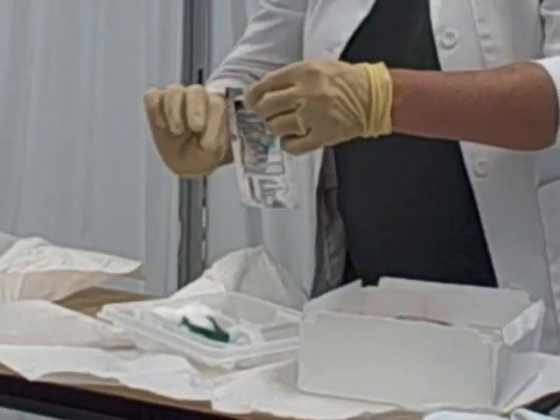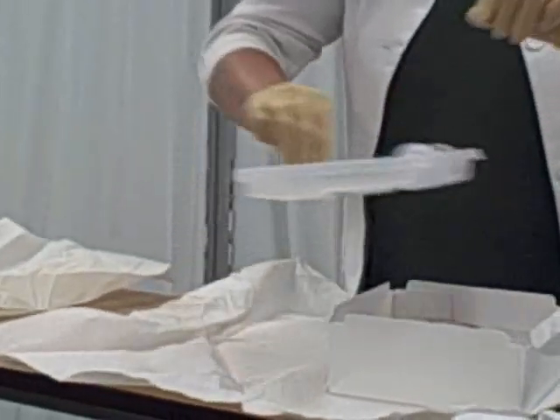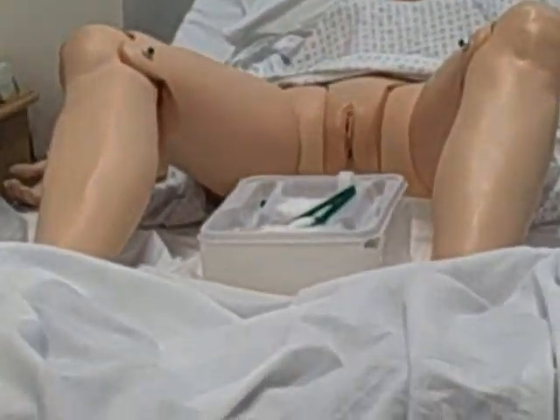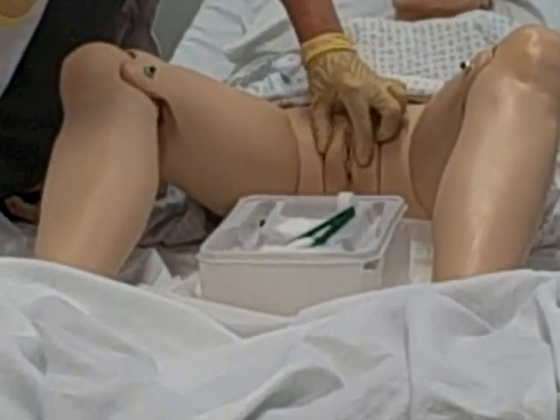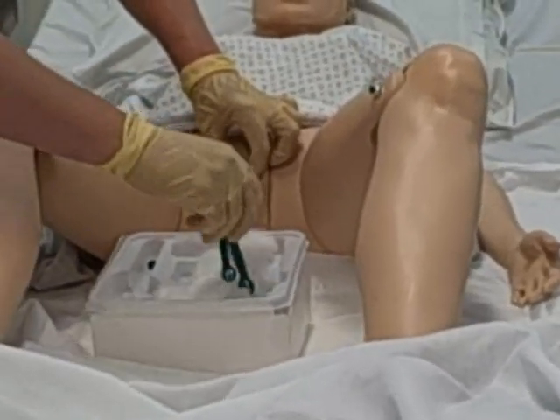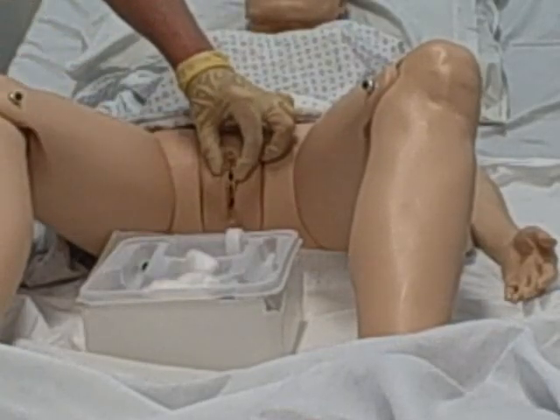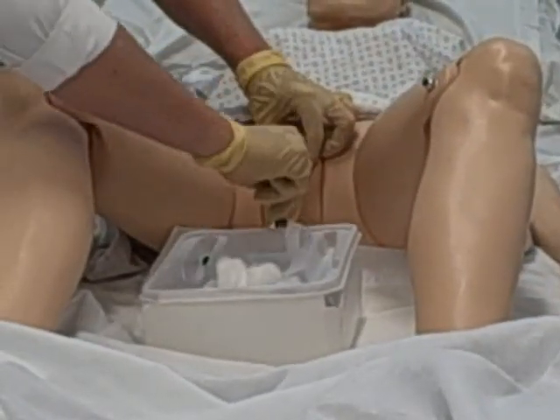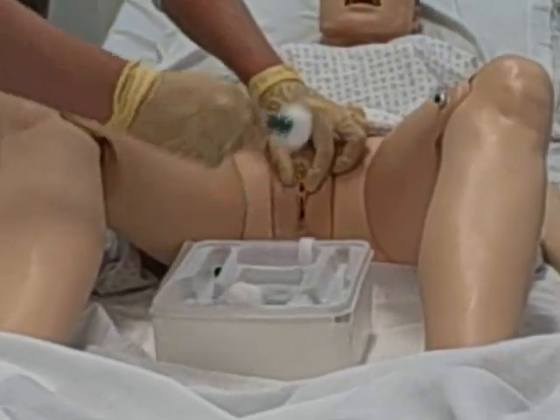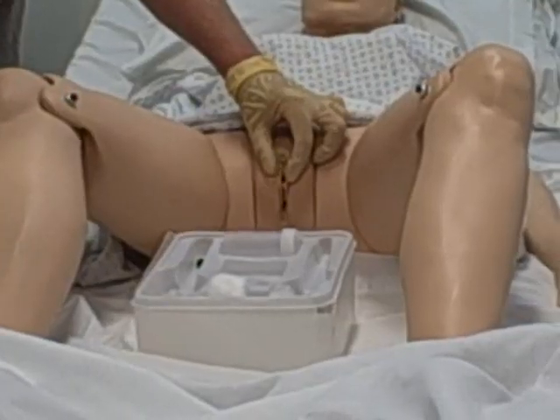The balloon is deflated but the syringe will remain in place. Lubrication will be squirted into the sterile tray and the tip of the Foley catheter will be lubricated. Betadine will be gently squirted onto the cotton balls. The kit is now put back together and transferred to the sterile field between the patient's legs. The student's hand will be placed on the patient — this hand is now committed and will not move. The urinary meatus will be visualized and the student will clean from top to bottom: first on the far side, then the near side, then twice right down the middle. Note how the student did not contaminate the sterile field with her right hand while discarding items in the trash.